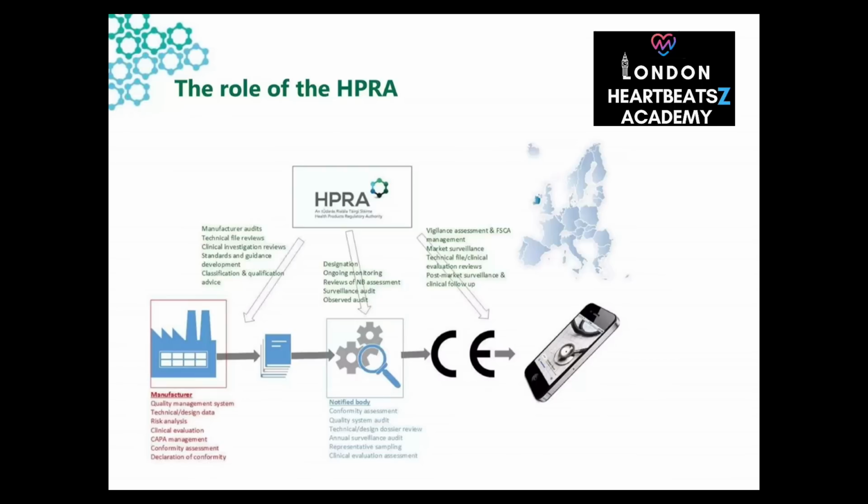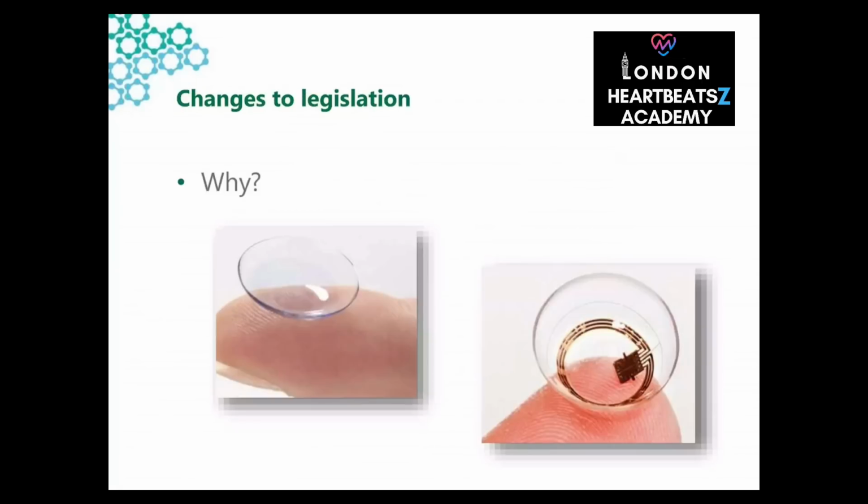Yes, absolutely. So what happens if a manufacturer finds a problem? They have to report it to the authorities like the HPRA, and then they need to implement corrective actions. What kind of actions? It could be fixing a bug, issuing a safety warning, or even recalling the software. So there's a whole system in place, even after it's being used. Yes. What's indirect harm? So with traditional devices, it's clear how a malfunction could harm a patient, like a faulty implant. Exactly. But with software, it might be less obvious. How so?